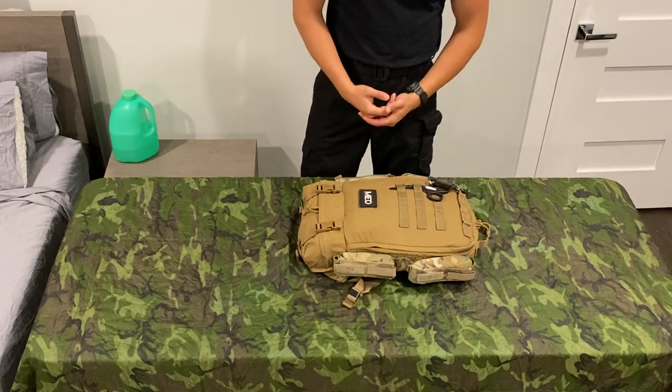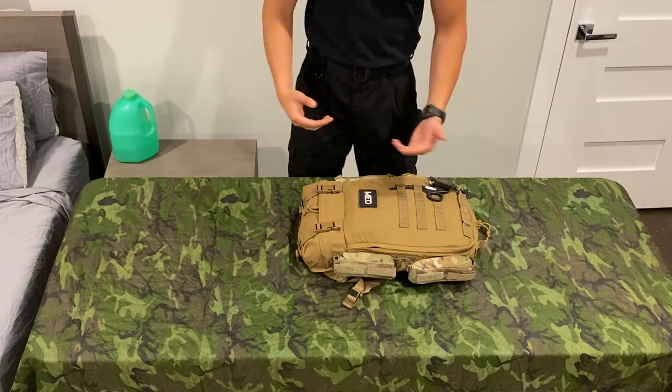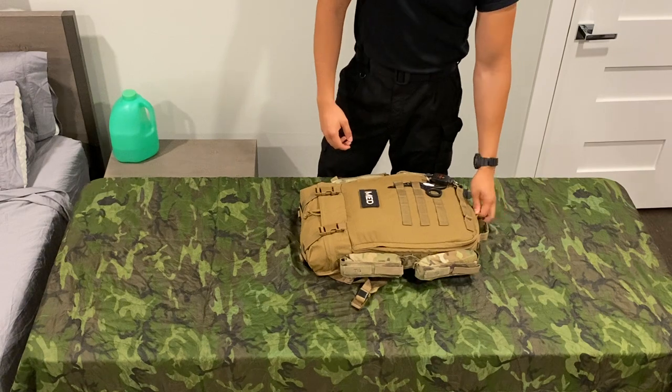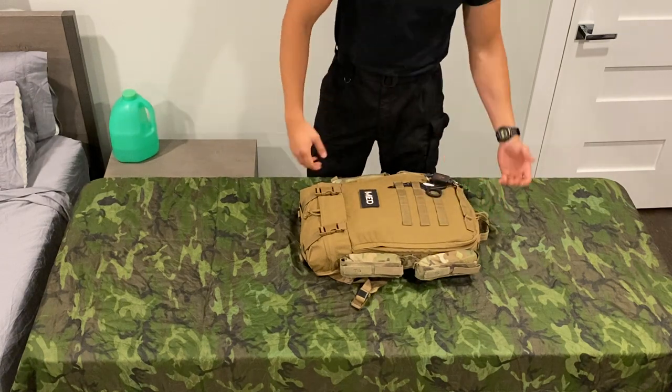Obviously if it's something super basic, you might just have a glorified band-aid backpack. But if you're like a trauma surgeon rolling out on some Andrew Fisher type situation, you're going to have all kinds of stuff in here.